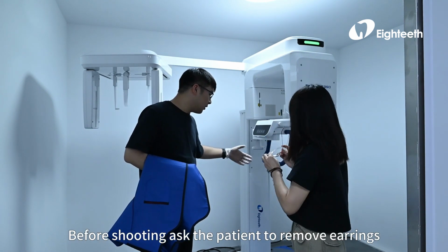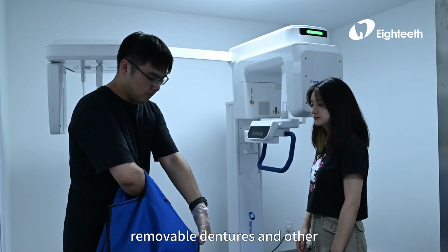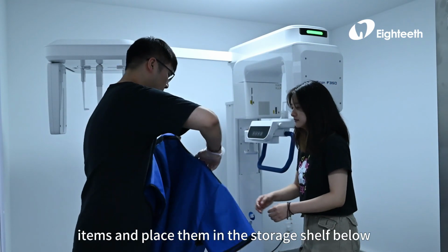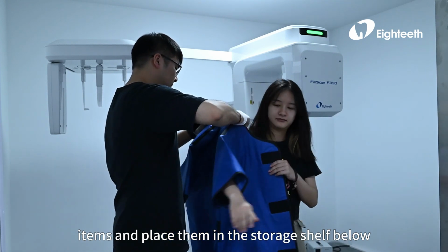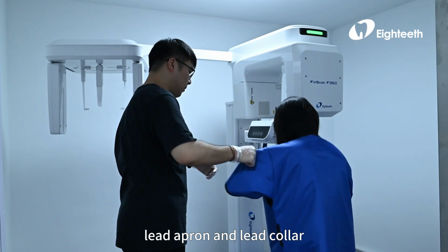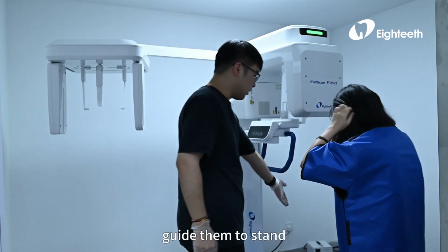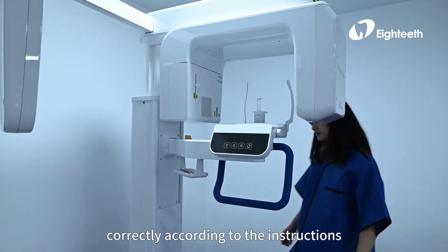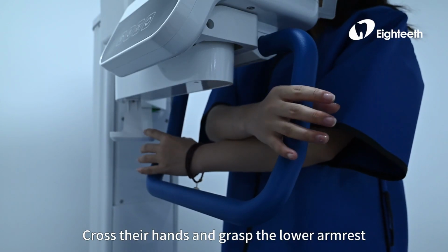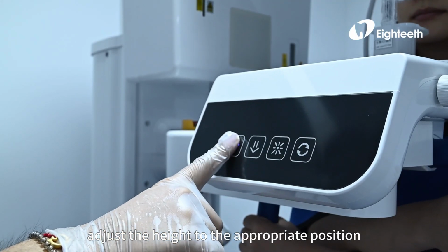Before shooting, ask the patient to remove earrings, studs, glasses, removable dentures, and other items, and place them in the storage shelf below. Guide the patient to properly wear the lead apron and lead collar to avoid artifacts. Once the patient is ready, guide them to stand correctly according to the instructions. Cross their hands and grasp the lower armrest. Adjust the height to the appropriate position.